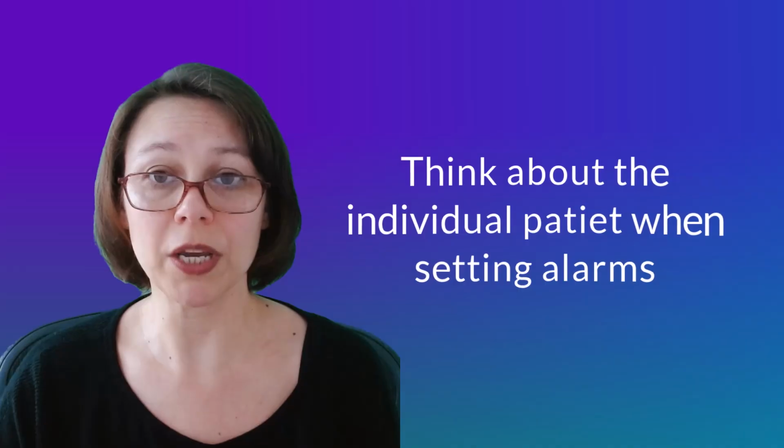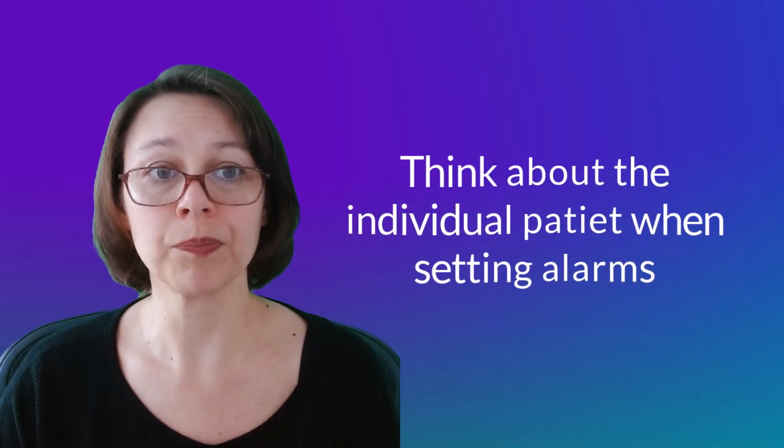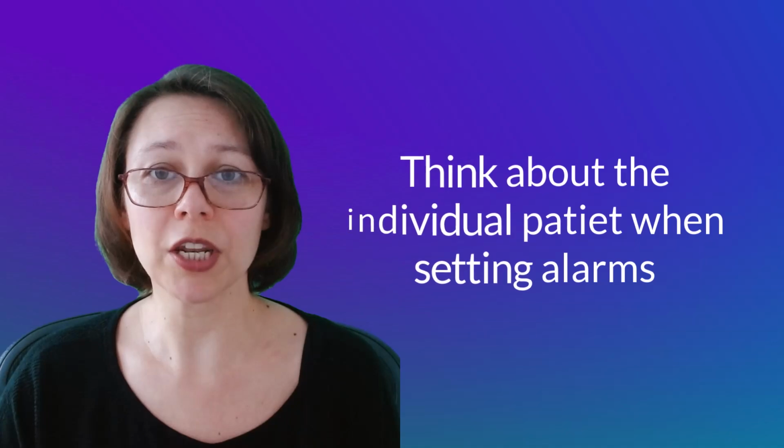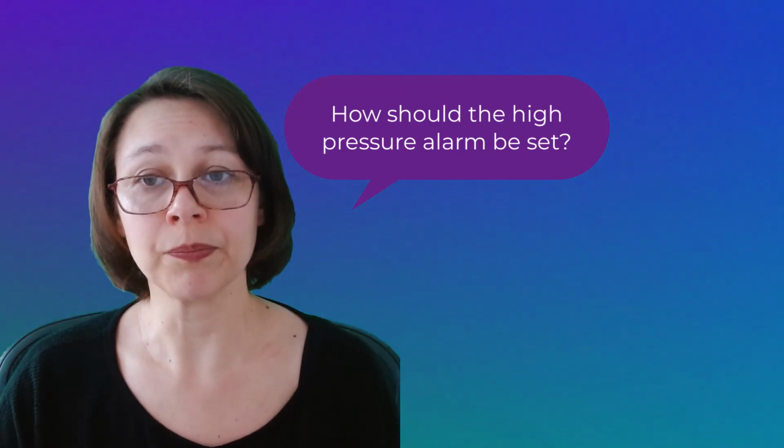There are guidelines on how to set alarms. However, there's also real patient care. Every alarm should be set to each individual patient, but there's also hard limits to where things should be. We'll spend a few episodes talking about alarms, but we'll start with the high pressure limit, probably one of the most common ones. So first, how should it be set?